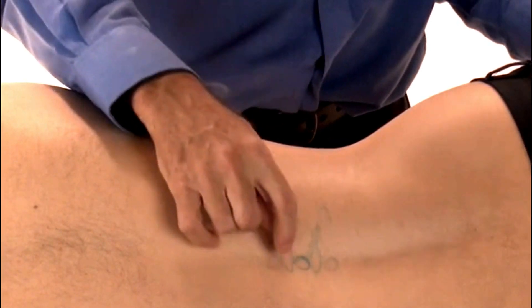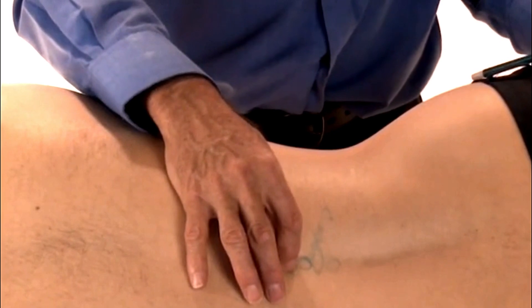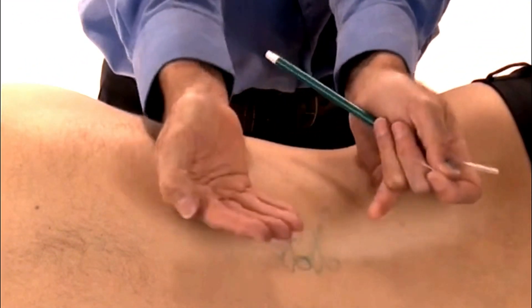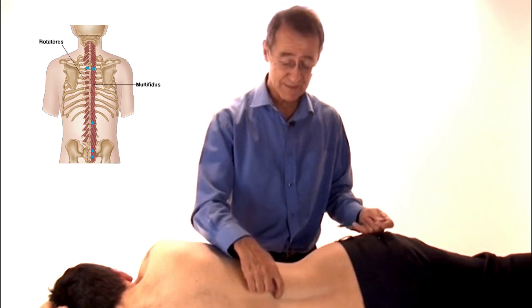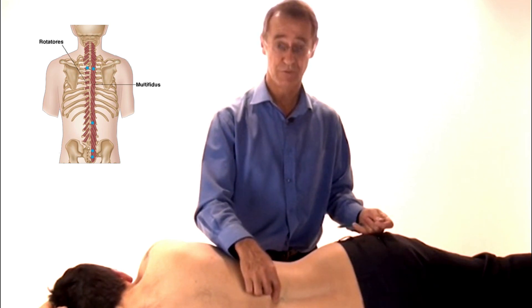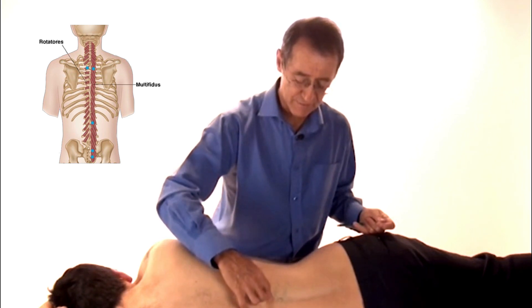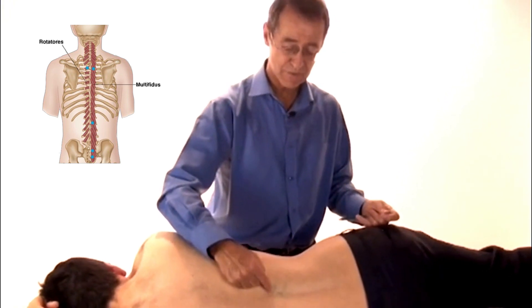It's difficult to get in there — as an anaesthetist doing epidural injections, people have to roll up into a ball to open up that space. But if you're using needles in the spine, you need to know that the space between the dorsal spines is taboo for you. To be safe, you feel the dorsal spine and go one finger breadth lateral to the dorsal spine.